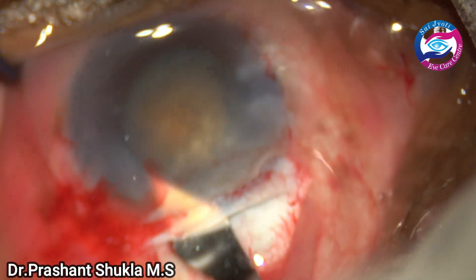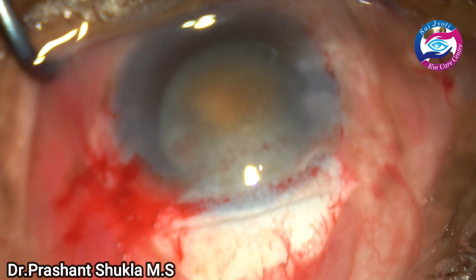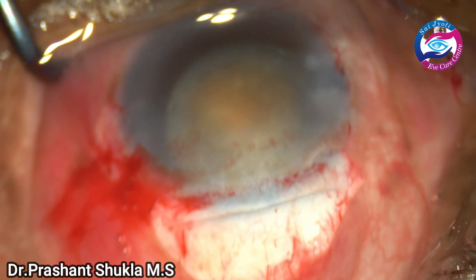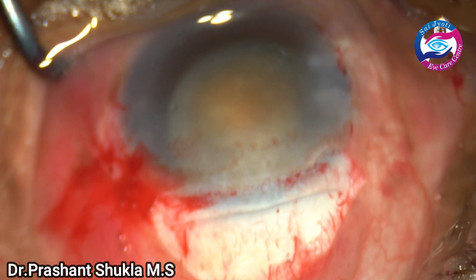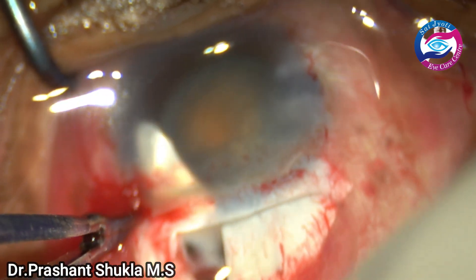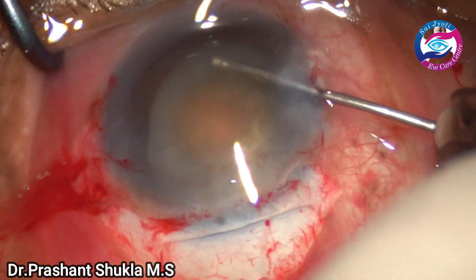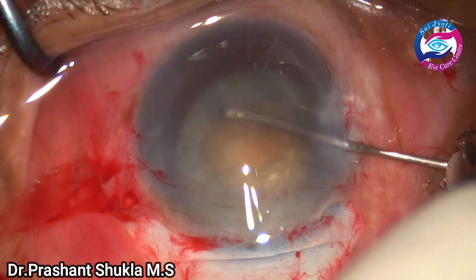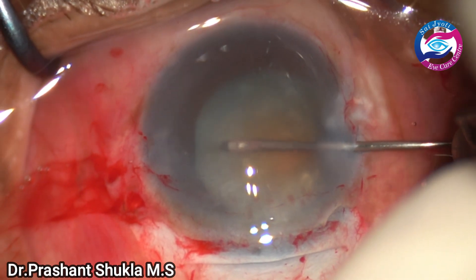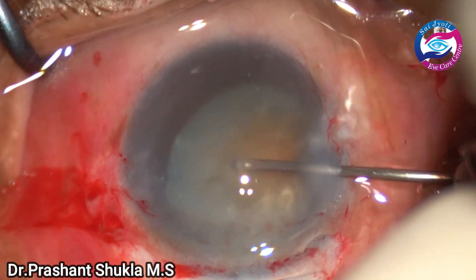Extending on the left side — I felt that the keratome was not cutting smoothly, so I switched to the crescent blade. Some viscoelastic is filled just to have some space, and the crescent blade is used to extend the tunnel on the left side. Some more radial nicks are given on the left side of the capsule rhexis margin just to aid smooth delivery of the nucleus.